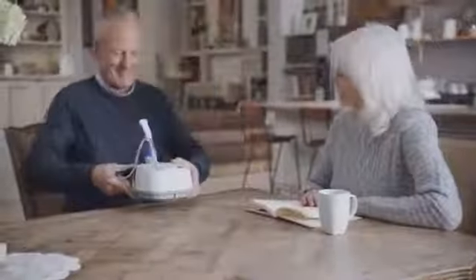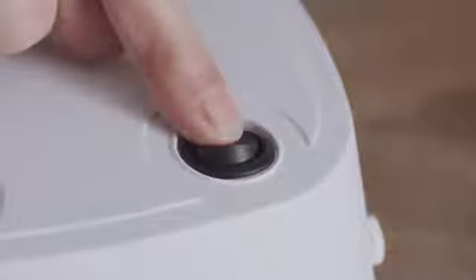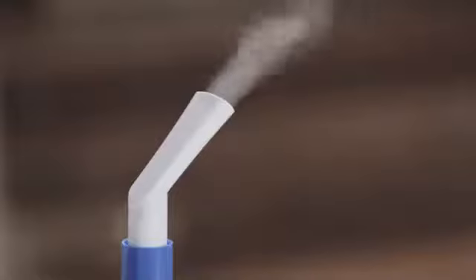To take the treatment, sit in an upright position, relax and switch on the unit. Make sure mist is visibly coming from the mouthpiece or mask. If using a mask, place securely in position over your nose and mouth and breathe slowly in and out through your mouth. Or, if using the mouthpiece, take it between your teeth, surround it with your lips and breathe in and out slowly through your mouth.